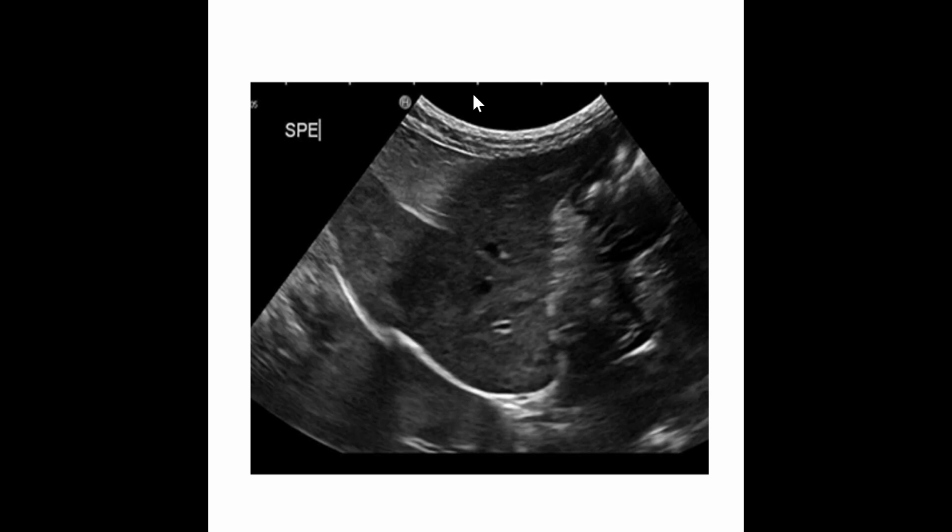Another way we could look at it without knowing for sure is that possibly the sound was traveling a little slower through this part of the medium. So this section of diaphragm maybe got placed a little bit deeper into the body.